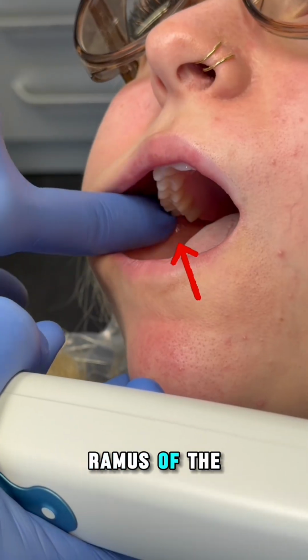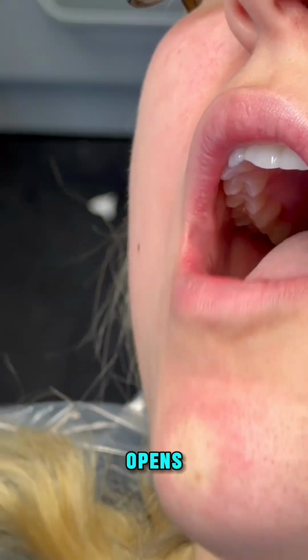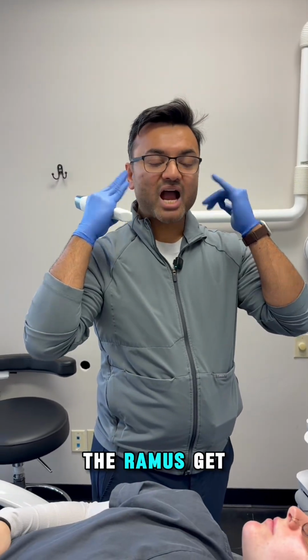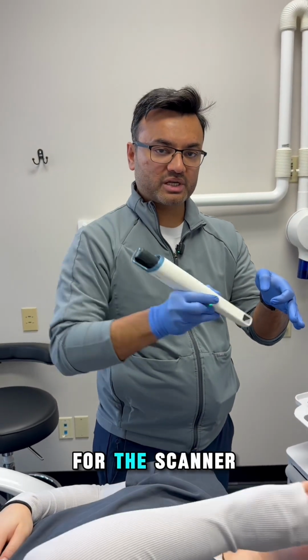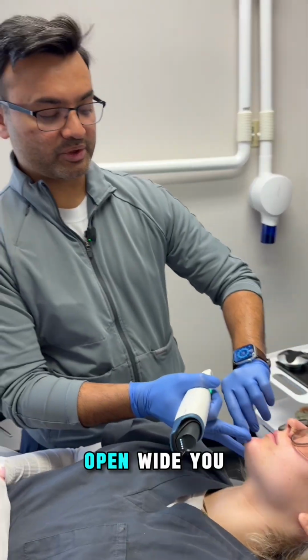Meaning that the ramus of the mandible is going to get, and the condyle, when the patient opens, think about the anatomy. When the patient opens, the condyle and the ramus get close to the second molar and the first molar, so you do not have enough space for the scanner to swivel around. So the way you want to do this, open wide.